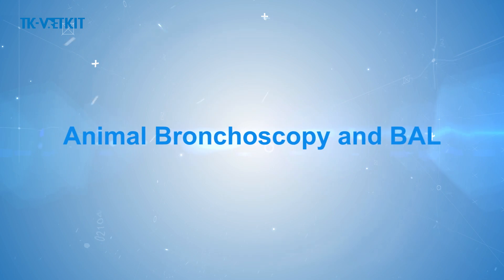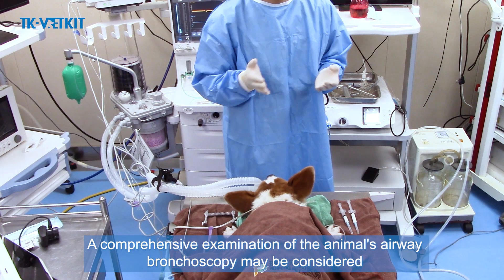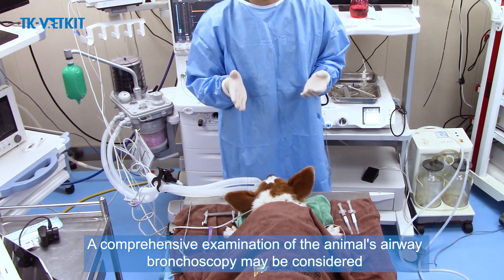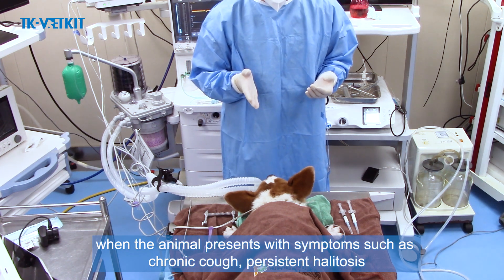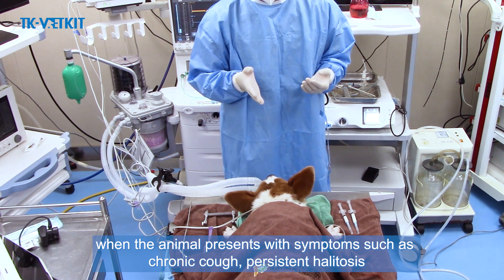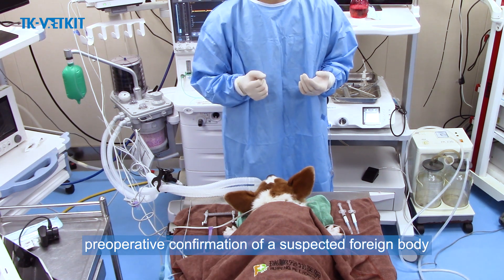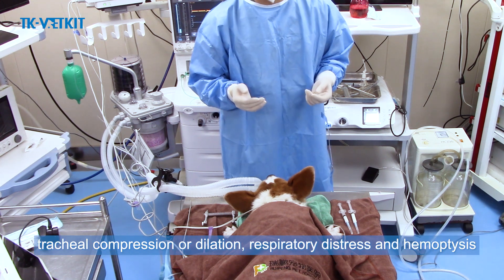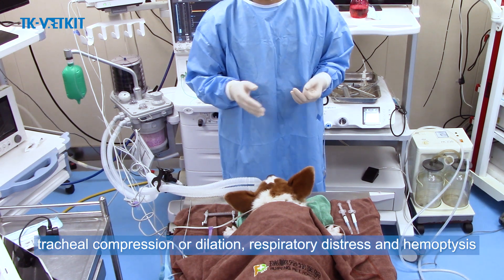Animal bronchoscopy: a comprehensive examination of the animal's airway. Bronchoscopy may be considered when the animal presents with symptoms such as chronic cough, persistent halitosis, preoperative confirmation of a suspected foreign body, tracheal compression or dilation, respiratory distress, and hemoptysis.